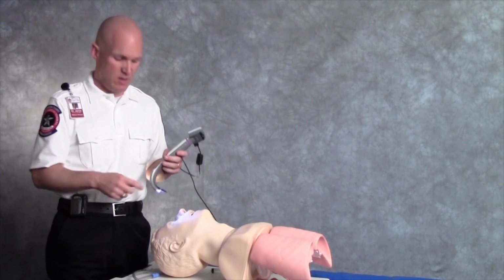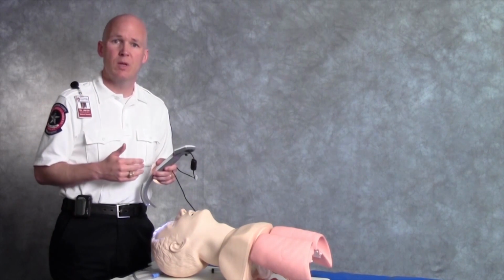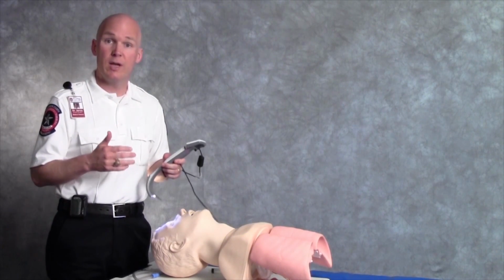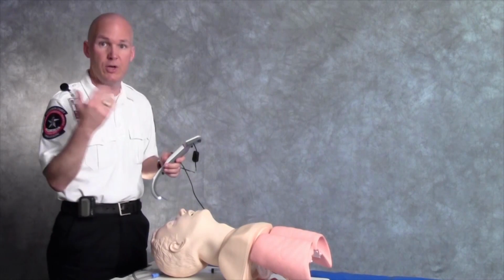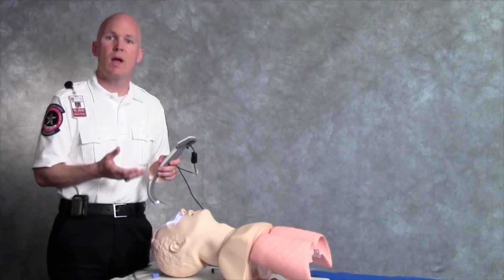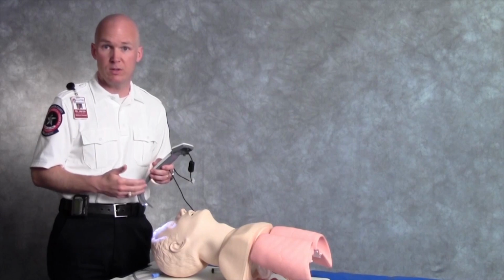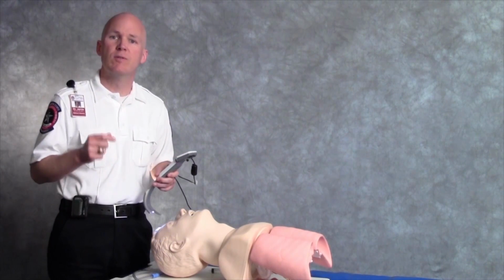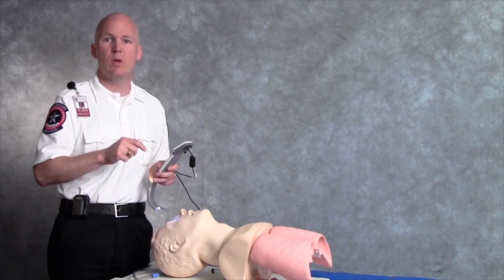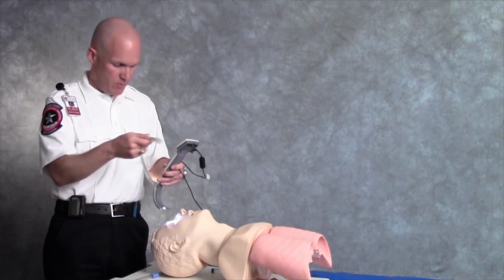So now let's look at the benefit of this channeled blade. Because this is not a displacing laryngoscope, it isn't designed to lift the tissues out of the way. It's not designed to create a direct line of sight between the cords and your eyes the way a direct laryngoscope does. Instead, it's designed to curve around those tissues and, in essence, put your eye directly in front of the cords. That's the point of the camera there. And this almost universally gives an incredible view. The challenge then becomes getting the tube to go where you want it to go. The channel helps guide the tube around the tissues and up through the cords.